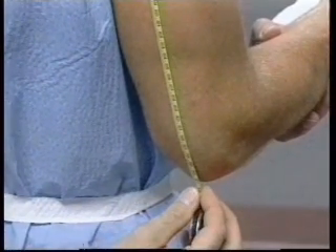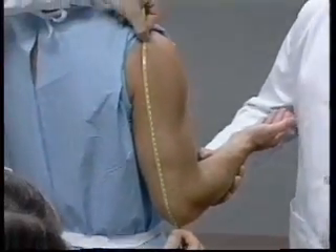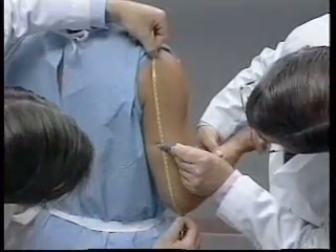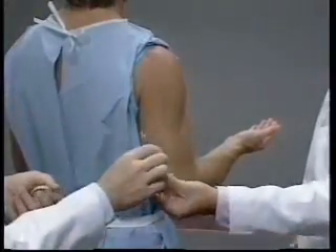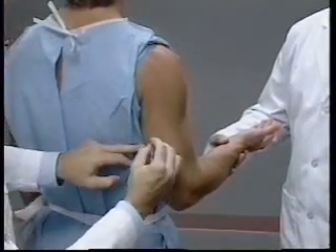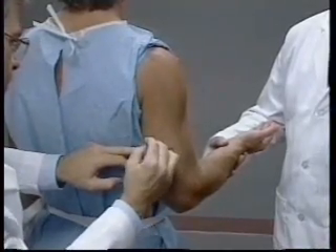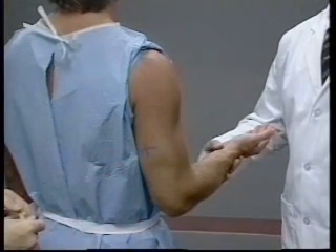The distance between the mark at the acromion and the tip of the olecranon is divided by two. A horizontal mark is made at the midpoint on the posterior aspect of the arm before the measuring tape is removed. This mark is then crossed with another mark that lies in a plane extending from the acromion to the olecranon. This point defines the site at which both the mid-upper arm circumference and the tricep skinfold are measured.